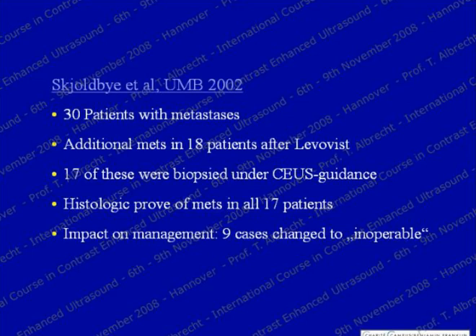Another study that I think is really quite interesting, again, it is a study that has histology as a real gold standard, albeit fine needle aspiration. 30 patients here, all with metastasis. Additional metastasis seen in 18 patients. This was still with Levovist. 17 of these 18 were biopsied under contrast-enhanced guidance, because they were obviously otherwise invisible, so you need contrast enhancement. And in all 17, there was histologic proof of metastasis.